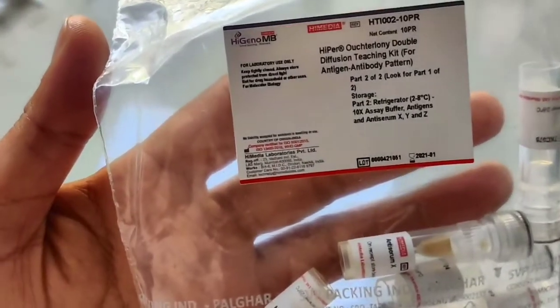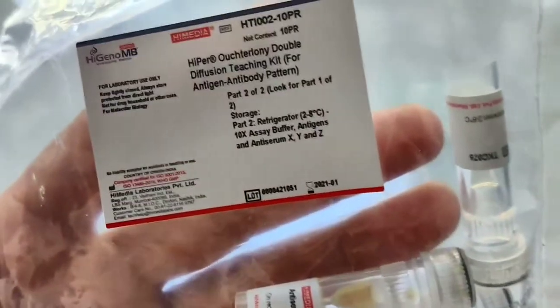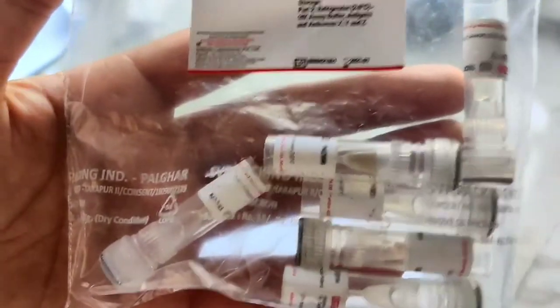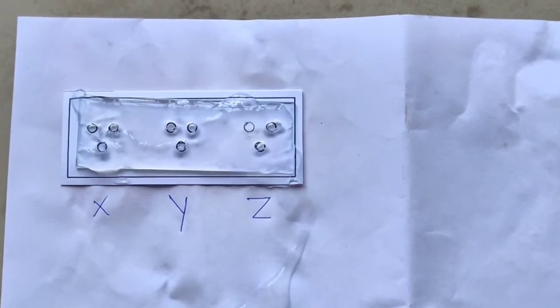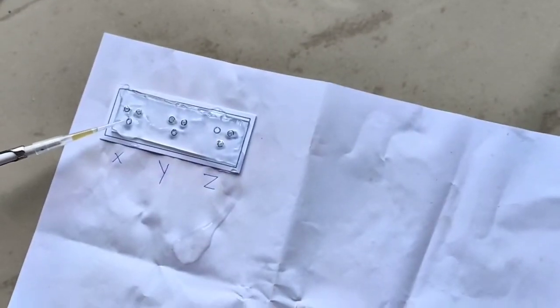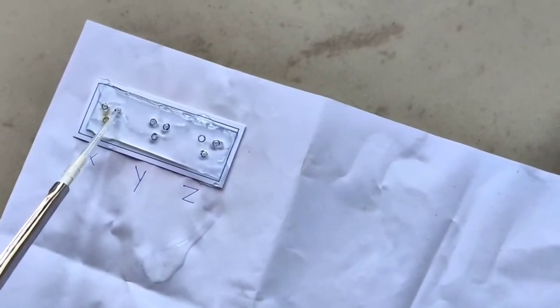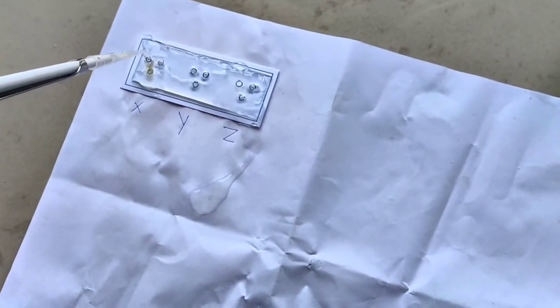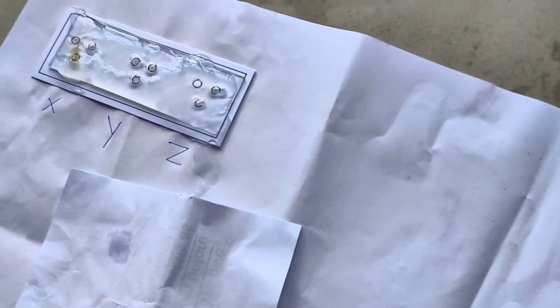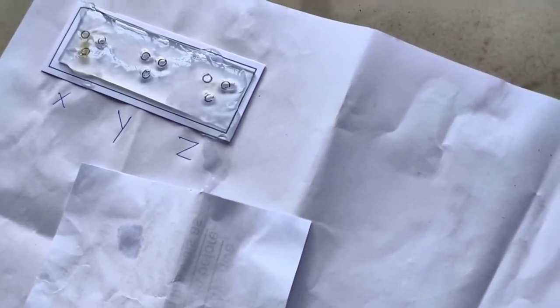These are the provided antibodies, antigens, and antiserums. We have 3 types of antiserums: x, y, and z, and 6 types of antigens. Mark the wells as x, y, and z. Pour 10 µl of antiserum x into the well, 10 µl of antigen x1, and 10 µl of antigen x2. Similarly, put y antiserum, then y1 antigen and y2 antigen, then z antiserum and z1 and z2 antigens.